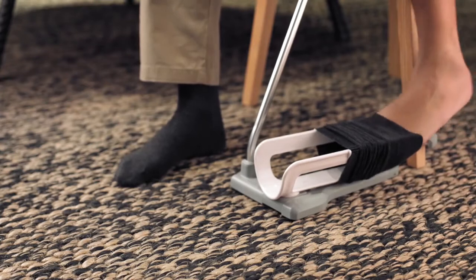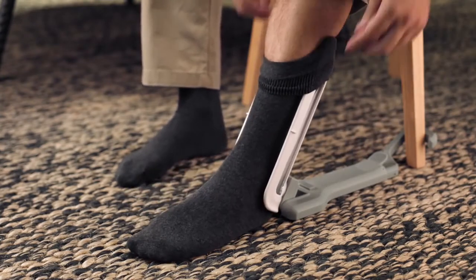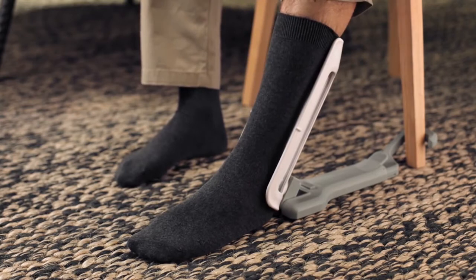Repeat the same steps for the other sock. When using long socks, finalize the action by pulling up the socks with your hands if necessary.